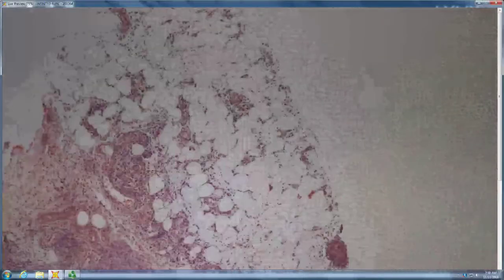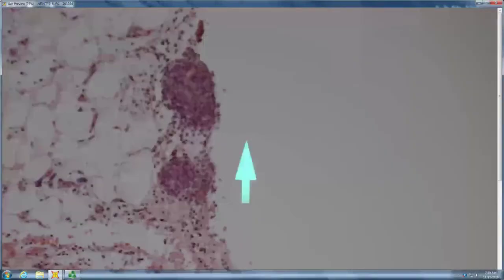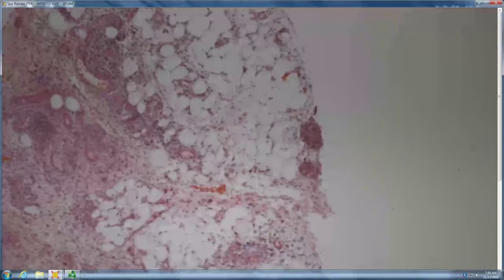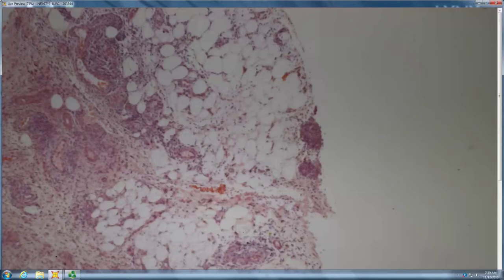And then it's like lobular panniculitis. So do you have necrosis of the lobule, or do you just have spillover of some inflammatory cells into the lobule? Definitely looks like some of them are a few different sizes, but the way that you worded that, I'm going to assume it's more... Yeah, I mean, this is subtle. They still have delicate membranes that look intact, so it's within the range you can see in a normal lobule.